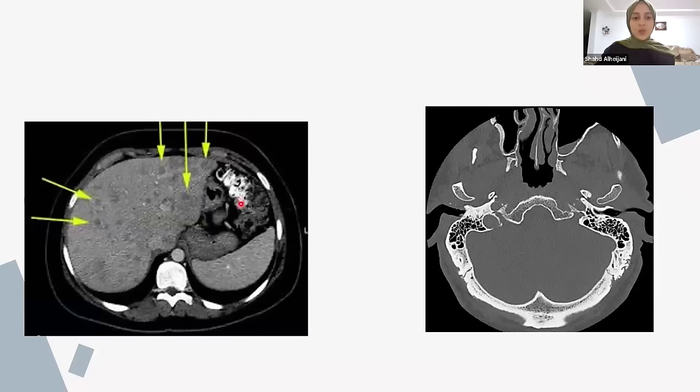Next one, here. Which organ is the clearest? Yes, liver. So this is the liver window. You can see those structures or those abnormalities in the liver the clearest. Meanwhile, if there's any abnormality in the mediastinum or other organs, you can't really tell, but the liver is the clearest. So you will focus the attenuation at the range closest to the liver. We said the soft tissue will be just above zero, so it's above water, but it's not as high as bones.